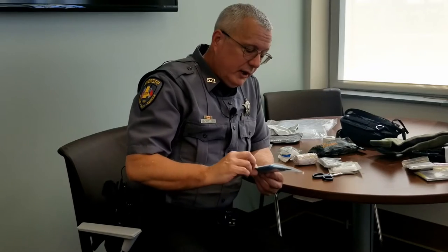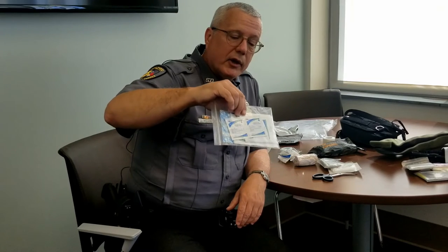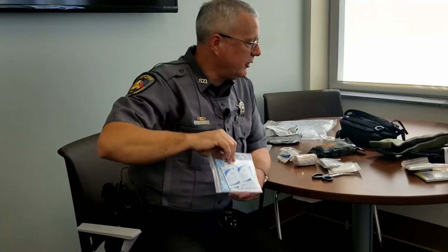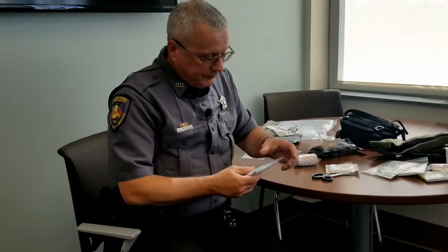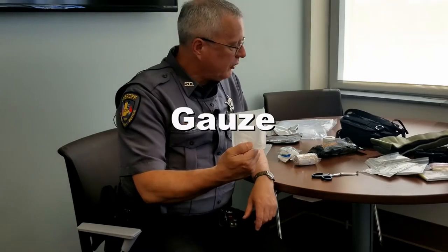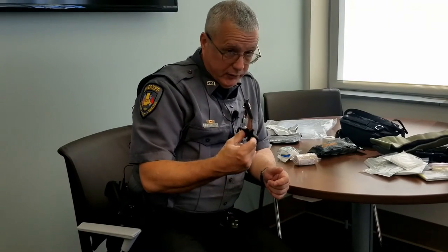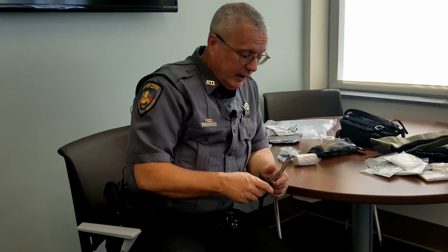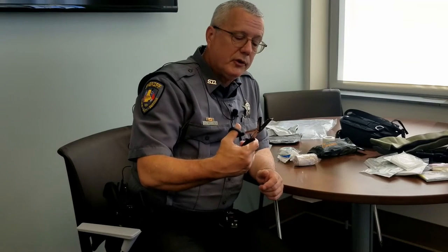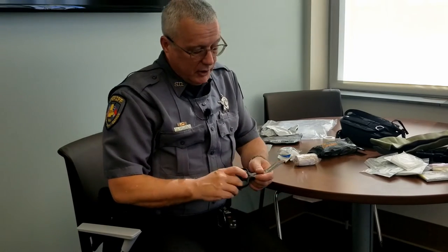This is what you'll probably use more than anything else — what we'd call a boo-boo bag. You've got a couple of band-aids, a couple of 2x2 gauze sponges, and some antiseptic wipes in there just for small lacerations, abrasions, anything of that nature. Some alcohol pads for cleaning injuries, and some more small gauze pads. And a pair of bandage scissors — these are a little smaller than you usually see, but they'll cut through just about anything: clothes, leather jackets. If you need to expose someone's chest to assess a torso injury, these will do the job.